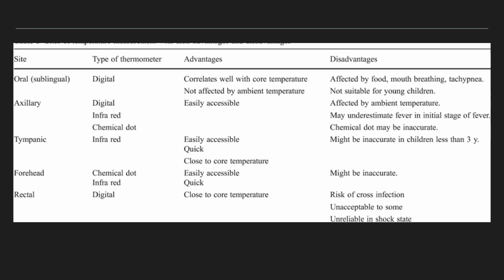Rectal. Rectal temperature measurement, once thought to be the most accurate and commonly used clinically, has now been replaced by tympanic technology that is less invasive for the client. Clients often do not tolerate rectal temperatures well because of discomfort and embarrassment.